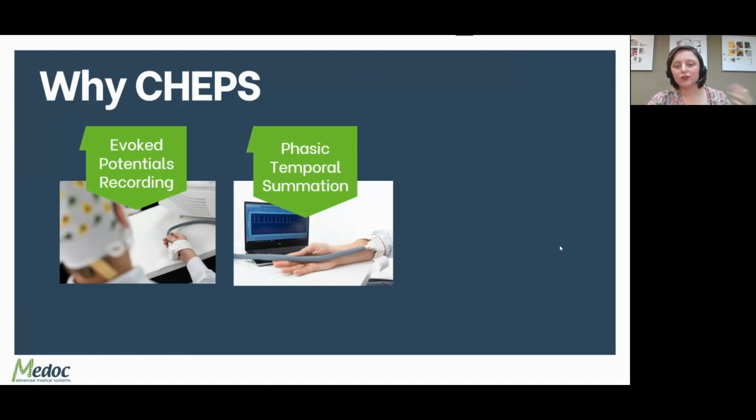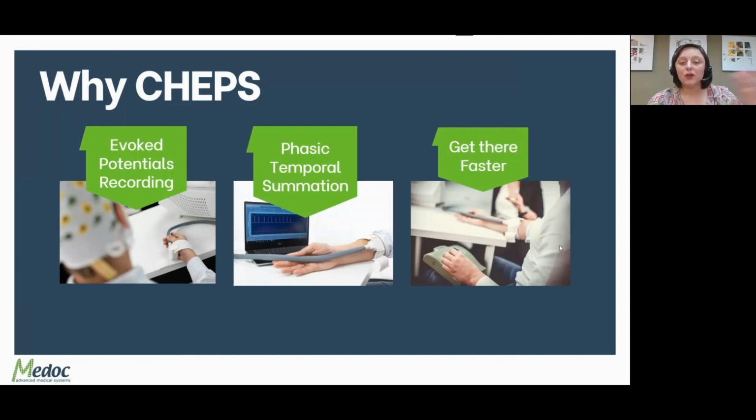You can start from the 32 neutral baseline and still be fast enough using the rapid rates. And you can have other reasons you want to get there faster. Maybe you have limited time for your paradigm and it is already long enough, and you want to shorten it by minimizing the ramping up and the going down time of your noxious and non-noxious stimuli.